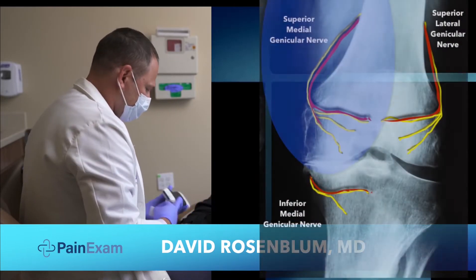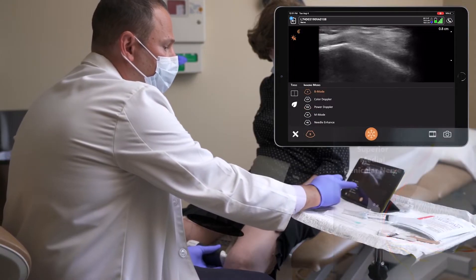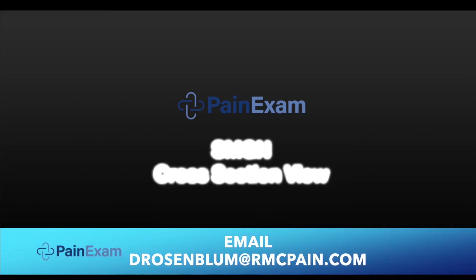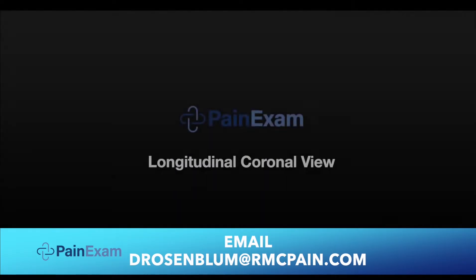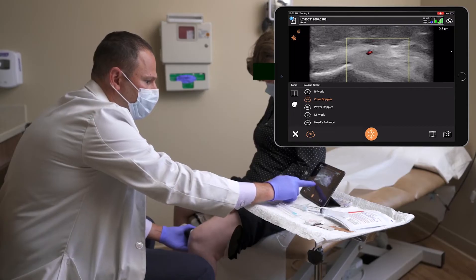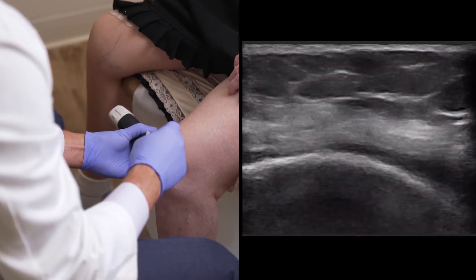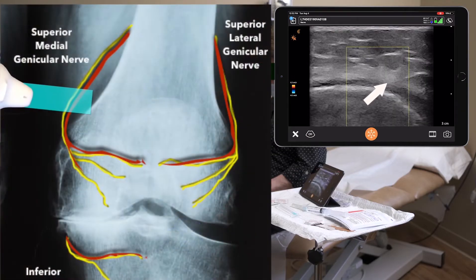Looking for the superior medial genicular nerve, I scan the medial side of the knee, putting on colored Doppler, laying along with the artery, close to the epicondyle. Taking off the Doppler, one can see the nerve next to the artery. Scanning distally, the nerve approaches the corner of the epicondyle with the blood vessel as it descends to innervate the knee.